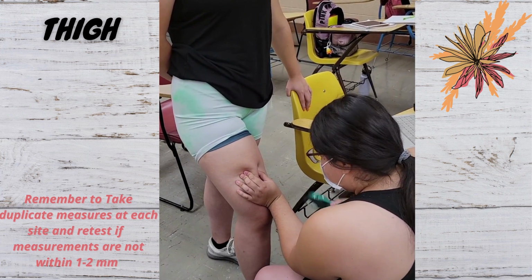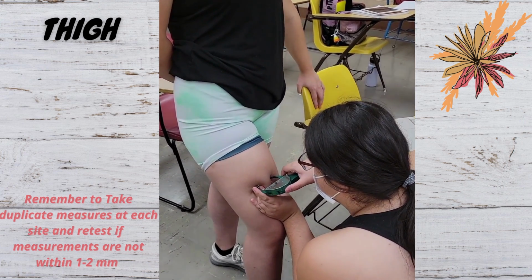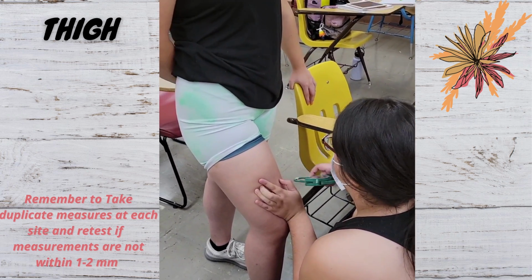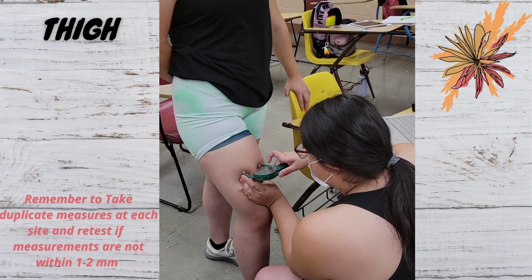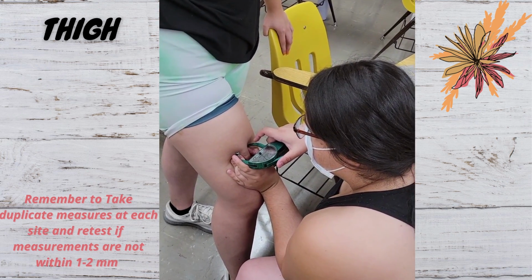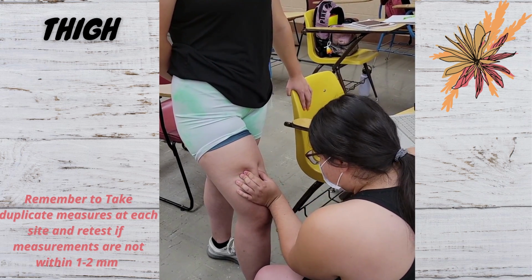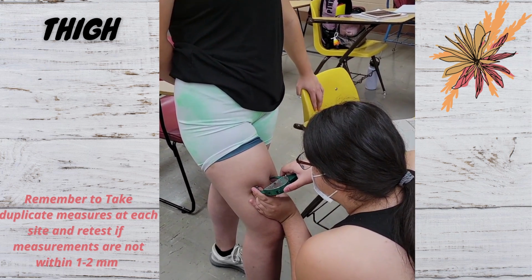To take the right side thigh measurement, you're going to pinch a vertical fold halfway between the knee and the top of the thigh. Use the skinfold caliper directly on the skin and pinch perpendicular to the vertical fold. Maintain the pinch for 1 to 2 seconds and then record your measurement.